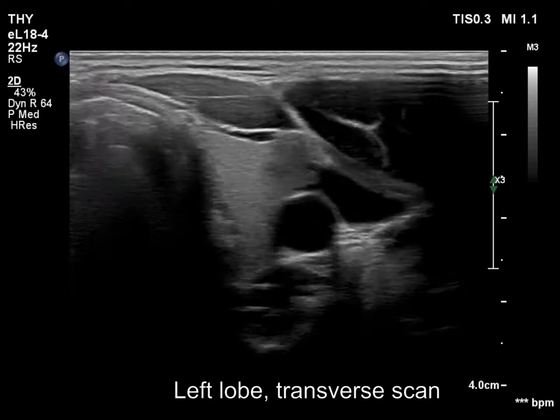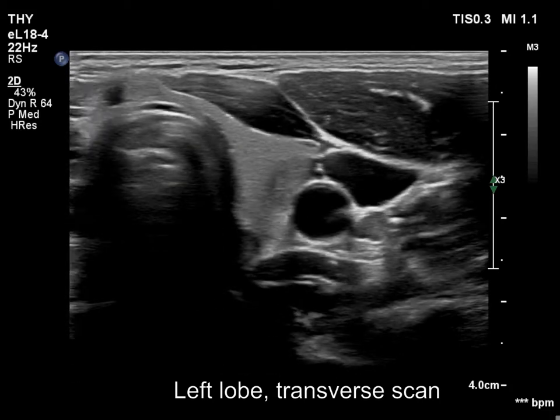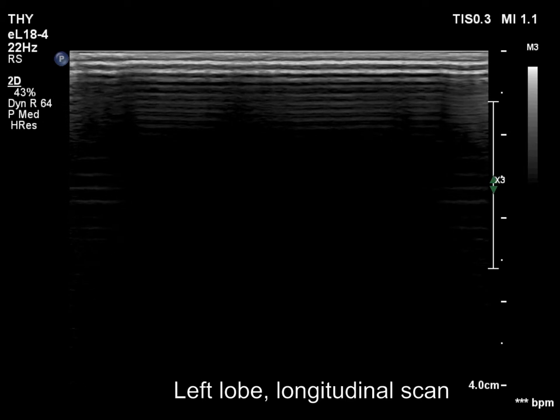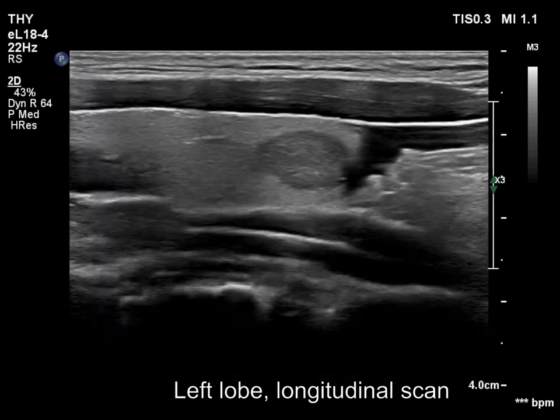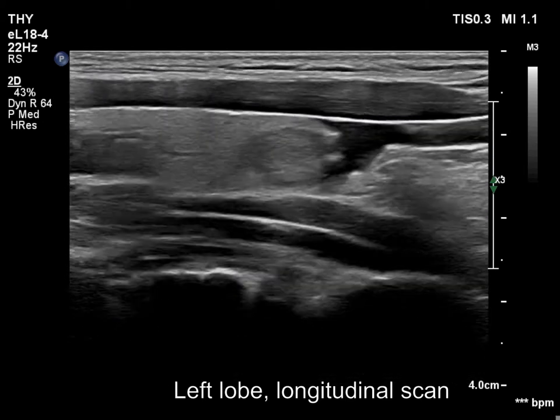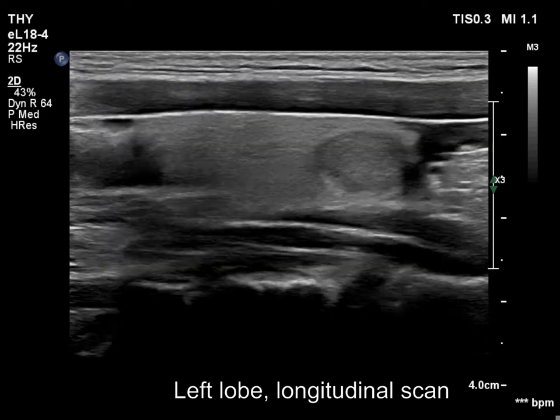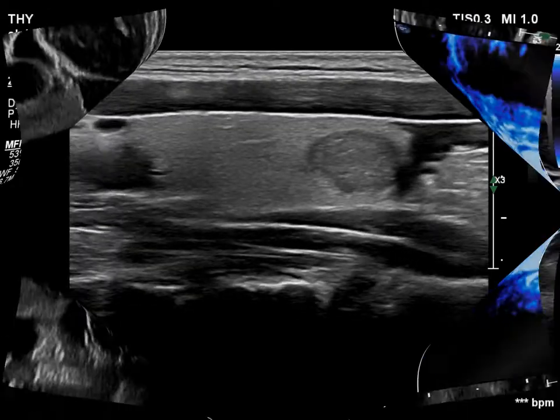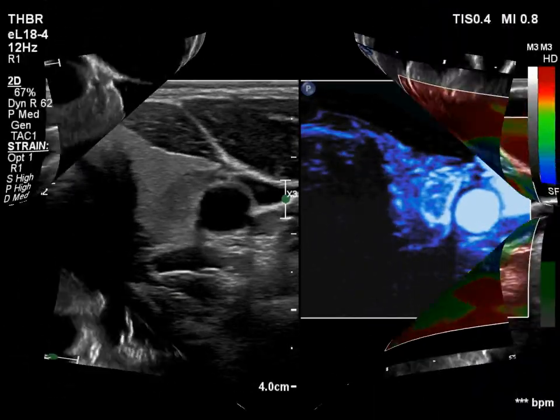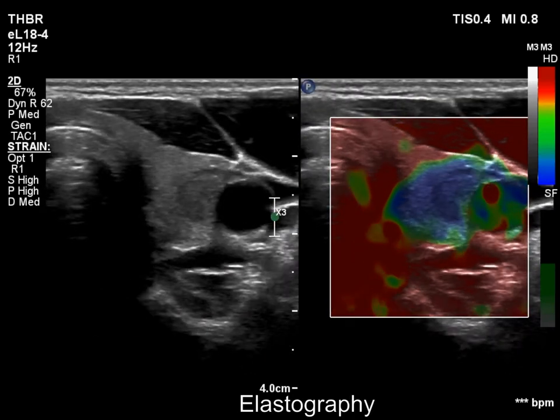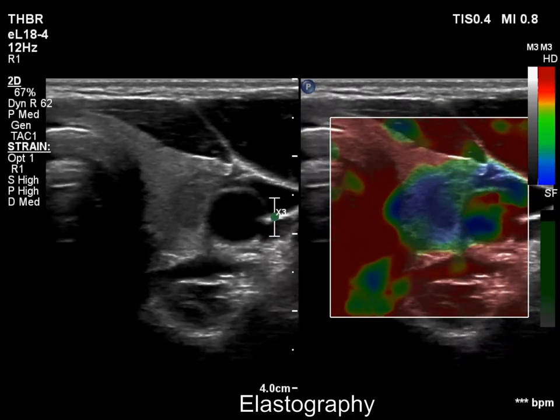There is a minimally to moderately hypoechogenic nodule in the left lobe. Longitudinal scan proves that this is a heterogeneous nodule which has a small echogenic portion in its dorsal part. The nodule is vascularized on microflow imaging, while proved to be soft on elastography.